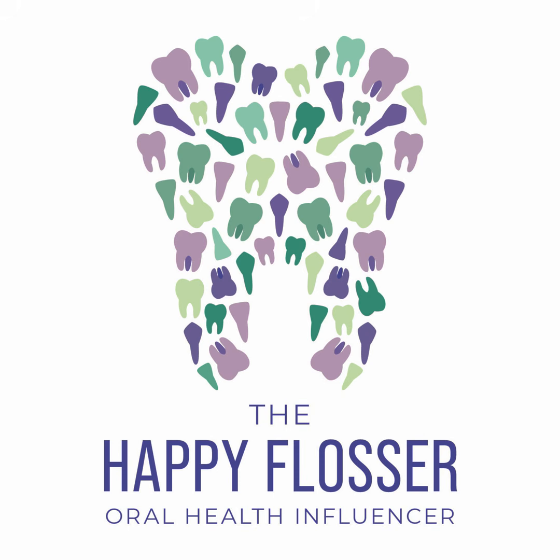And then what are you going to do with that impression now that you've taken it out of the patient's mouth? You are going to use a disinfectant, right? So you're going to rinse the impression using tap water and then spray it with some kind of disinfectant so that you are disinfecting that impression material before you take it into the lab.